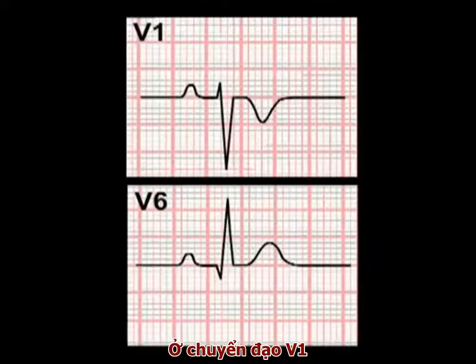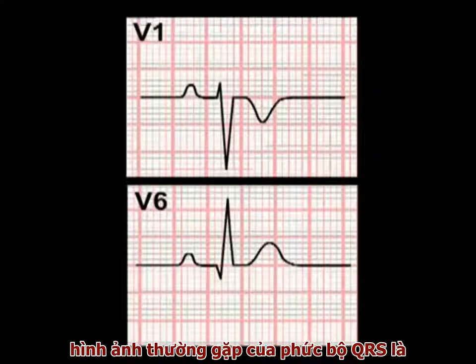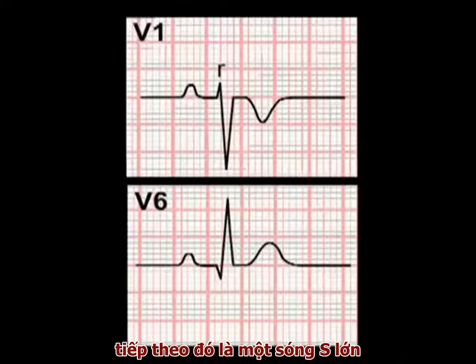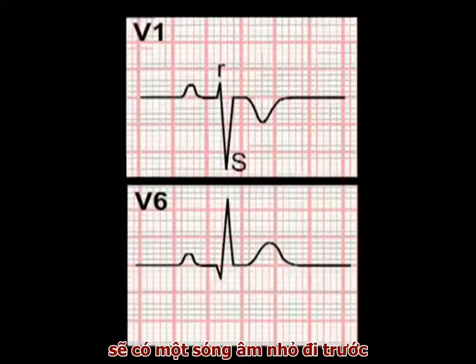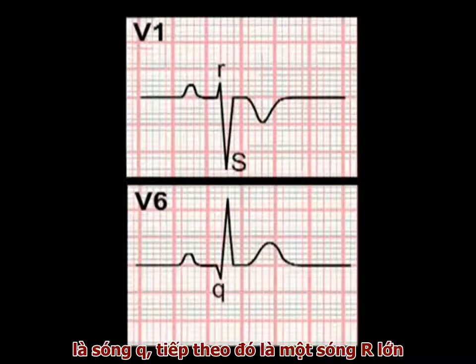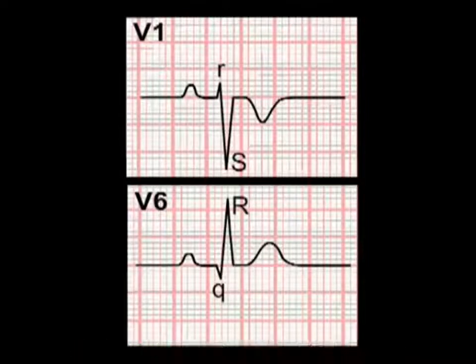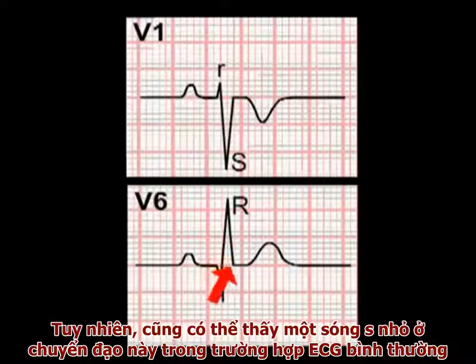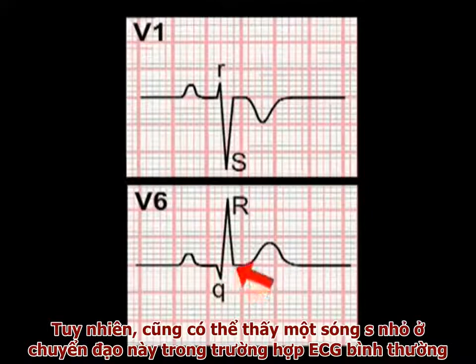In lead V1, the classical morphology of the QRS complex is a small R-wave followed by a larger S-wave. While in lead V6, an initial small negative deflection — a Q-wave — is followed by a large R-wave. In the example shown here, there is no S-wave present in lead V6, although a small S-wave is seen in this lead in many normal ECGs.